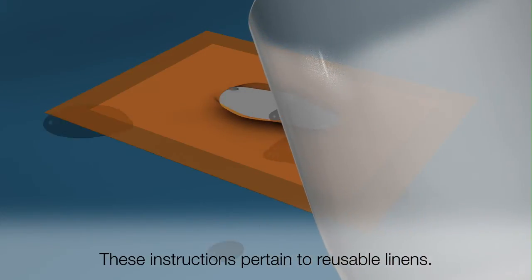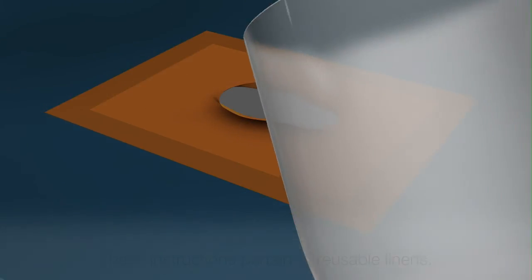First, wet the material, then peel the incise drape away from the linens, dispose of the incise drape, and process the reusable linens as usual.